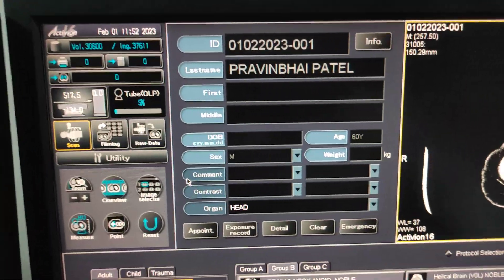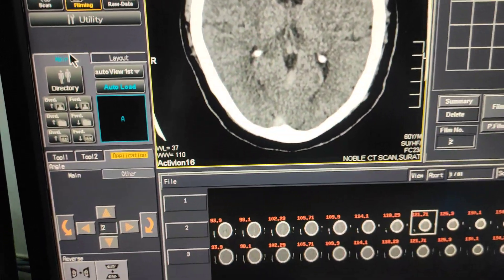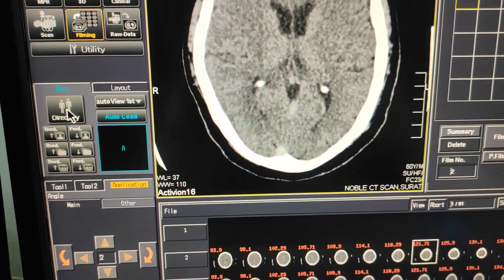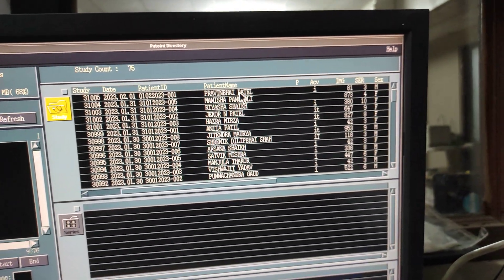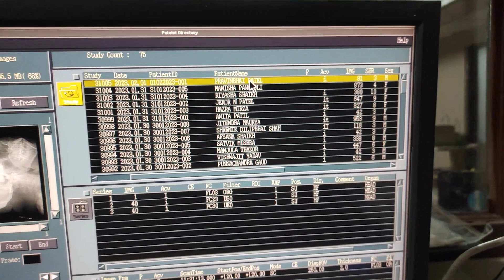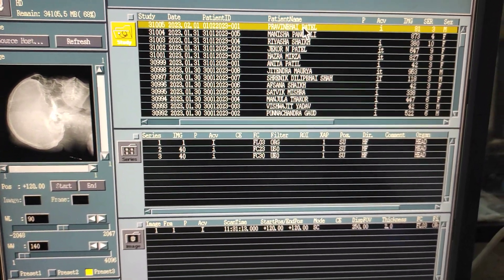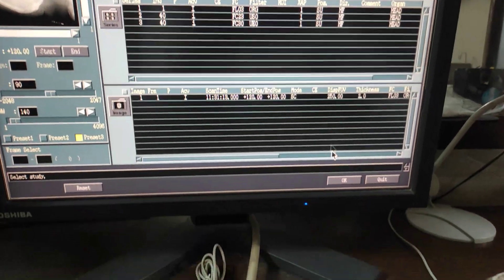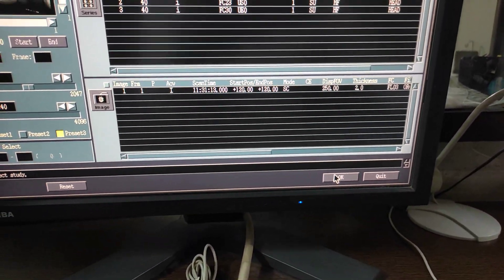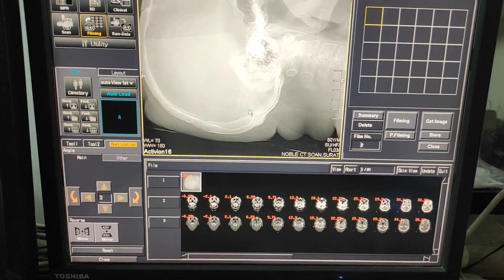For filming, first you have to click on the filming icon, select the directory, and open the patient list. Whatever film you have to do — here I am doing brain filming first. The data is now open.